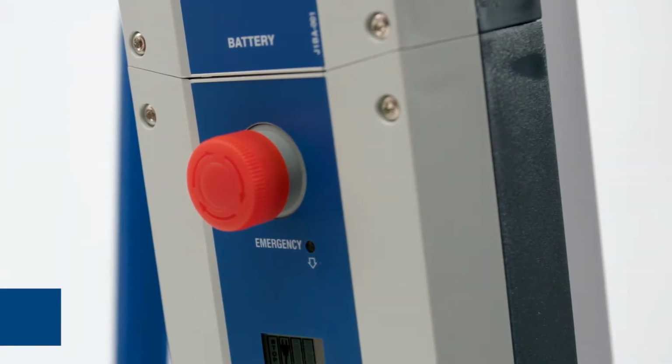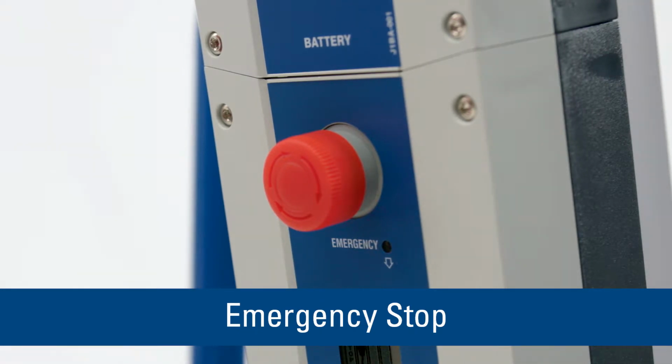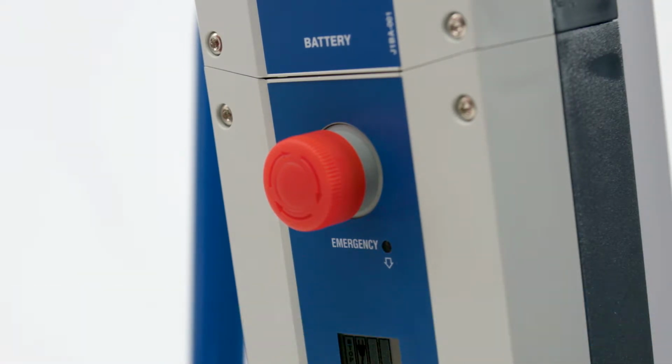To stop the boom assembly from raising or lowering, press the red emergency button on the control box. To disengage the emergency stop, rotate the red emergency stop button clockwise.